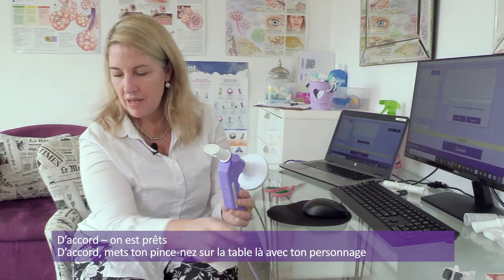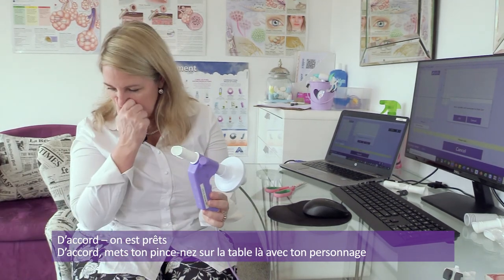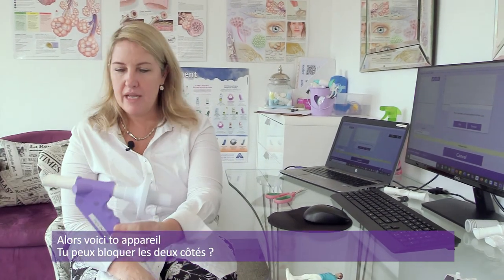Can you just put your mouthpiece and your nose clips on the table over here and put your little man down on the table. Good. Okay, so there you go. What we're going to do now is, can you just close it with your fingers on both sides? That's it. So we're setting the zero flow. Okay, we're ready.